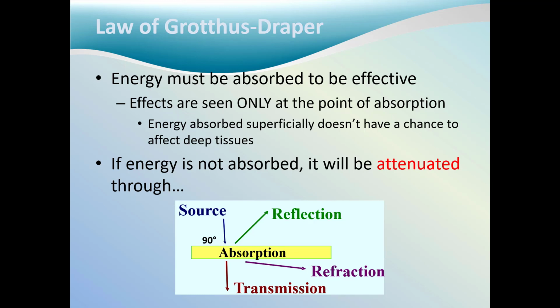Reflection occurs when the wave cannot pass through the next density. The wave strikes the tissue and reverses its direction away. Refraction is the bending of a wave as a result of a change in the speed of the wave as it enters a medium of different density. When the energy leaves a density layer and enters a less dense layer, its speed increases.